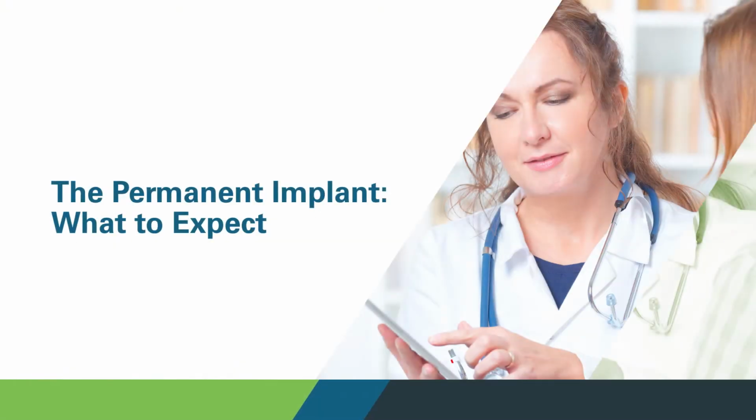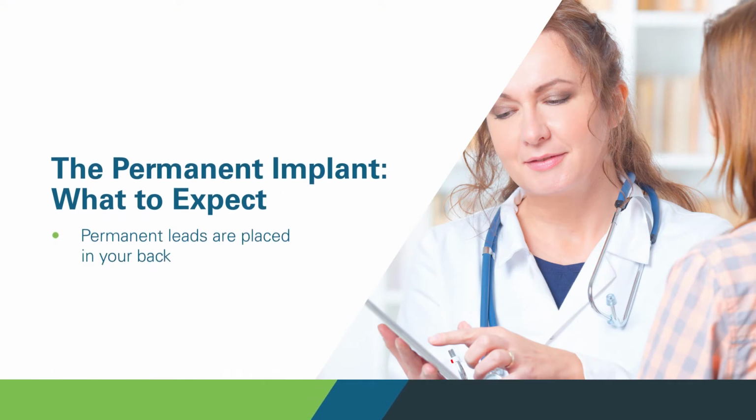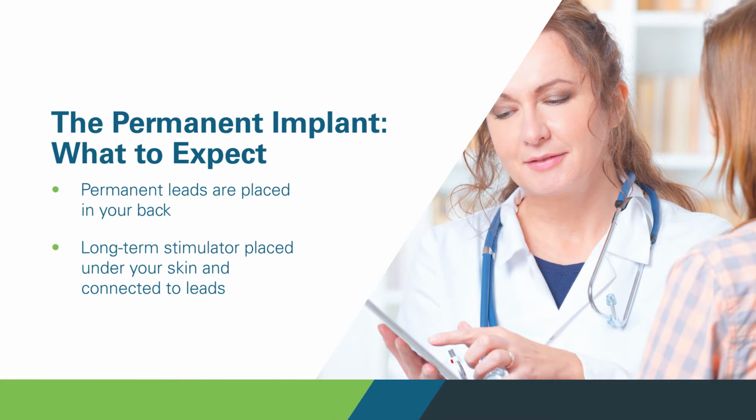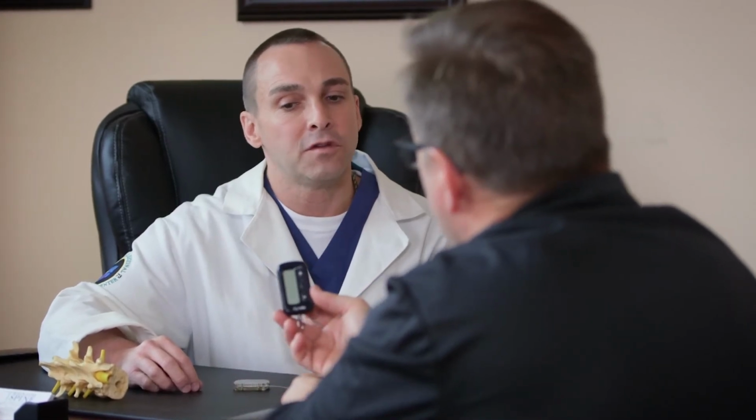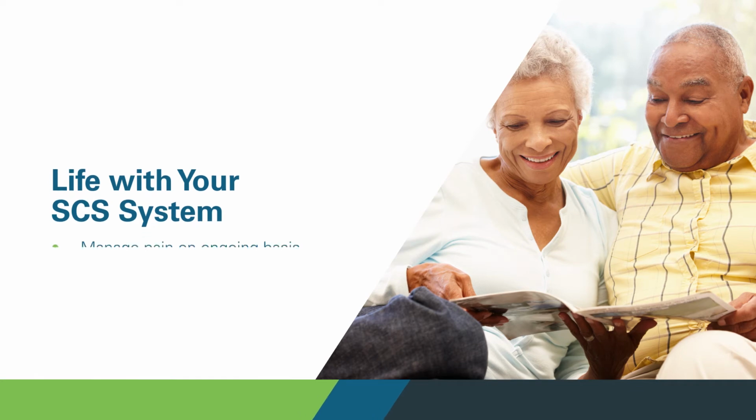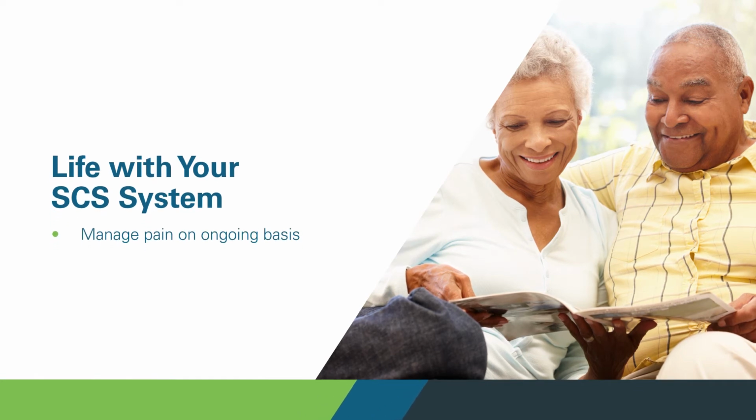The permanent implant, the leads are then anchored into position. They're then tunneled under the skin to put the pulse generator in. The leads are plugged into that generator and both incisions are closed up. When I see my patients back post-operatively on day 7, the patients are describing very little incisional pain. They're able to utilize the system well. After the procedure, you'll be shown how to manage your pain on an ongoing basis with your new SCS system.